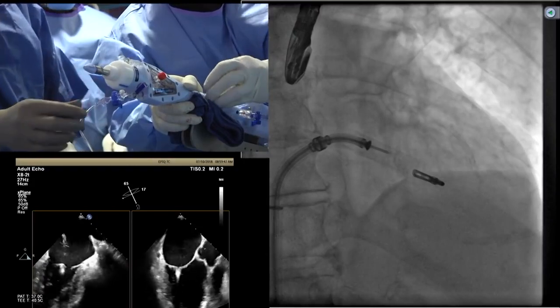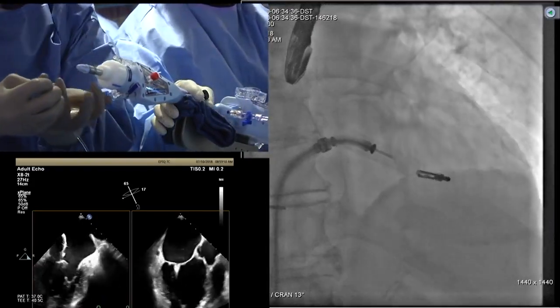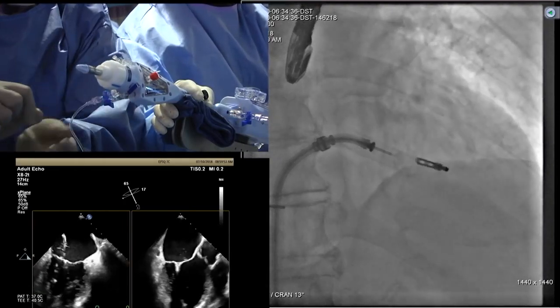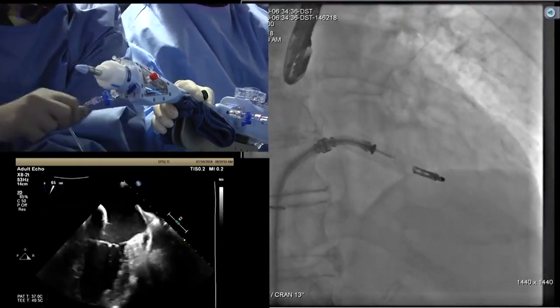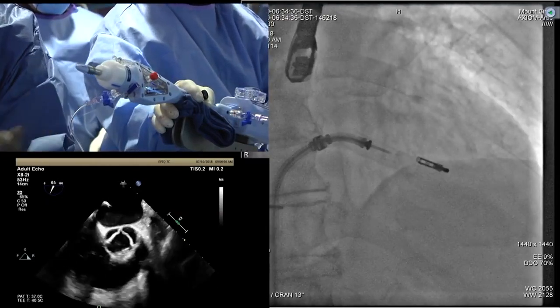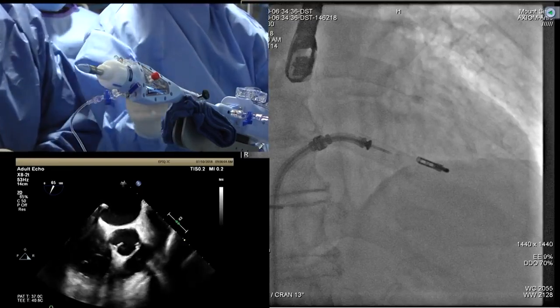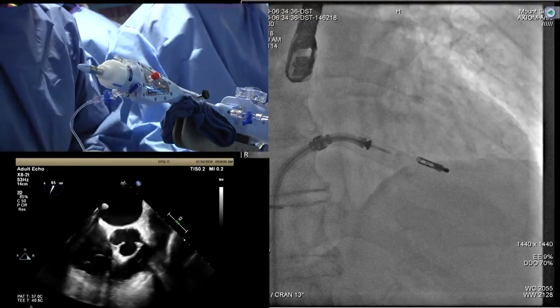All right. And then gripper line up, fluoro. And now when I take the gripper line, always watch the last thing, this is very important, especially some of us who do tricuspid work. The needle can get very close to the leaflet, so you have to be careful to watch under fluoro, because sometimes the gripper line can be under tension. Okay, the clip is completely released.